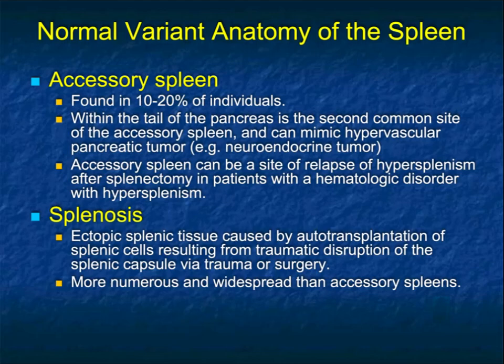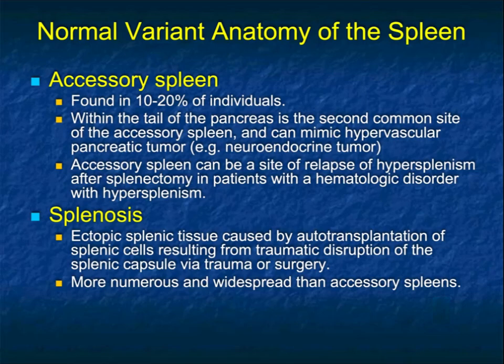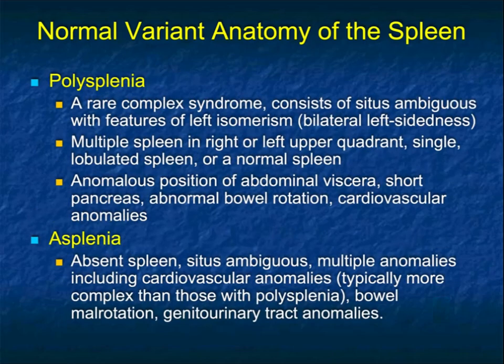Accessory spleens can be the site of relapse of hypersplenism after splenectomy in patients with hematologic disorders. Splenosis is typically associated with trauma — it's ectopic splenic tissue caused by autotransplantation of splenic cells from traumatic disruption of the splenic capsule. Most cases of splenosis we see are in patients who had traumatic splenectomies, though it can occur with splenectomy for other reasons. Sometimes when the spleen is removed, small accessory spleens enlarge and become more visible. Splenosis lesions tend to be more numerous and more widely distributed than accessory spleens.